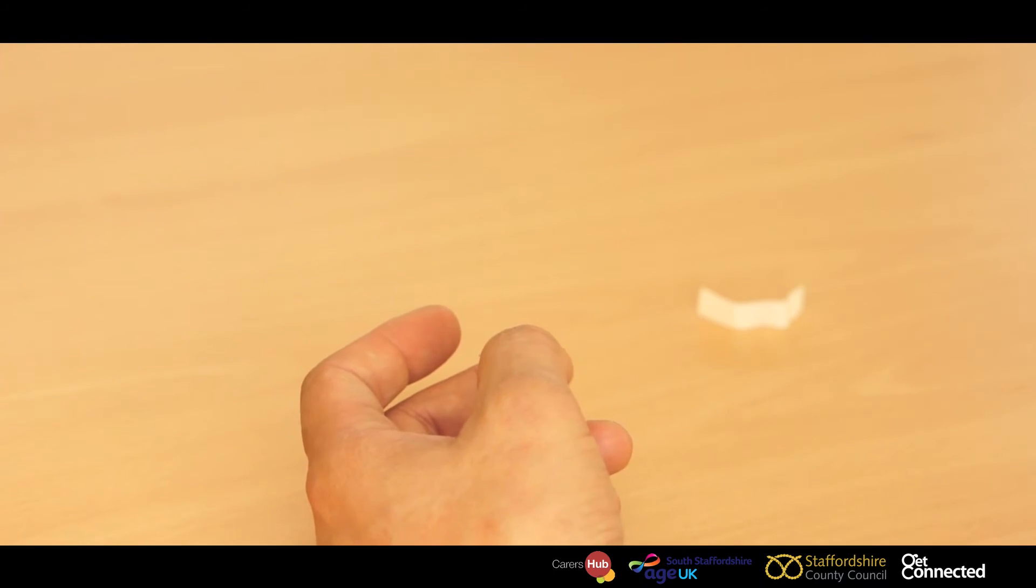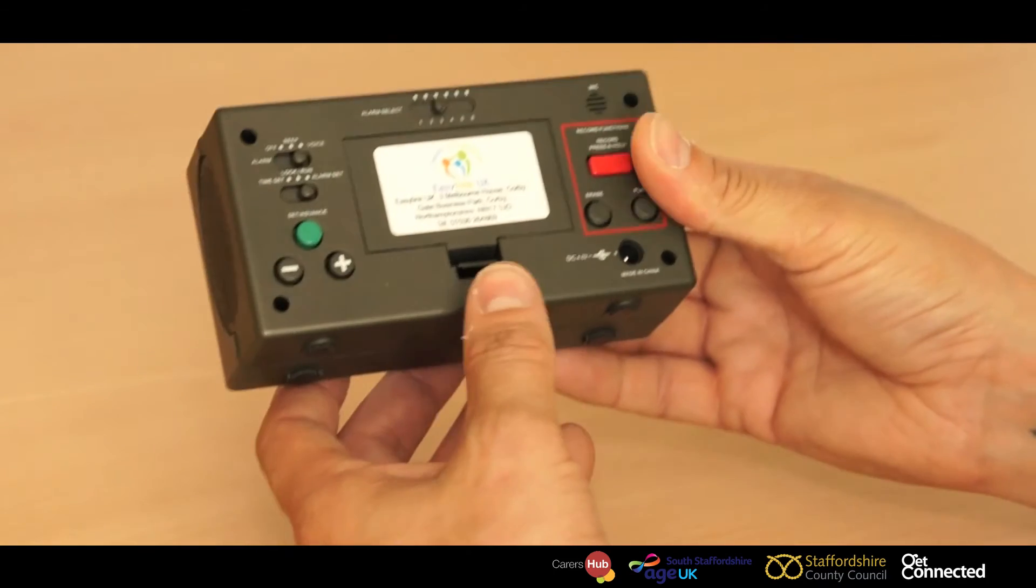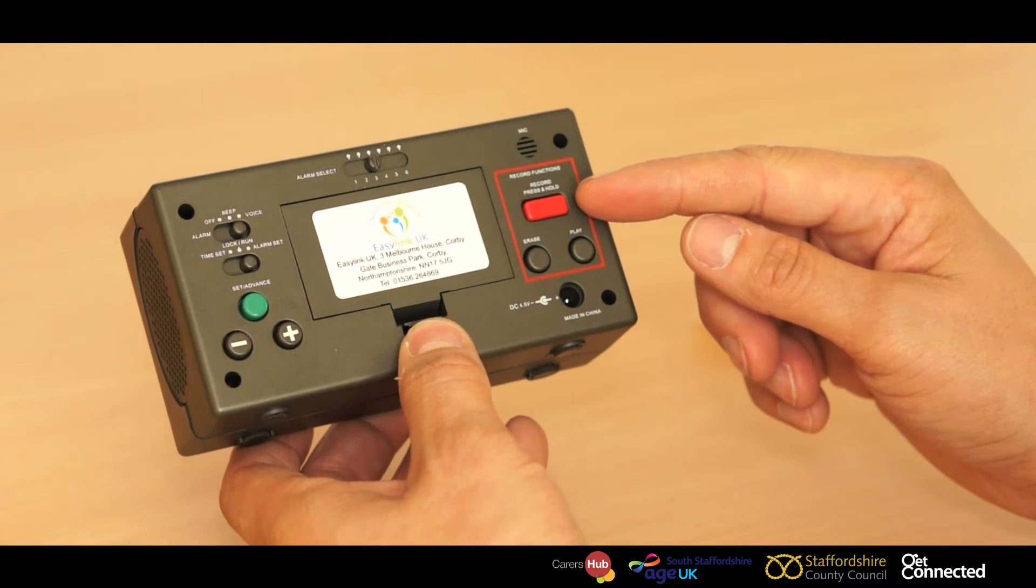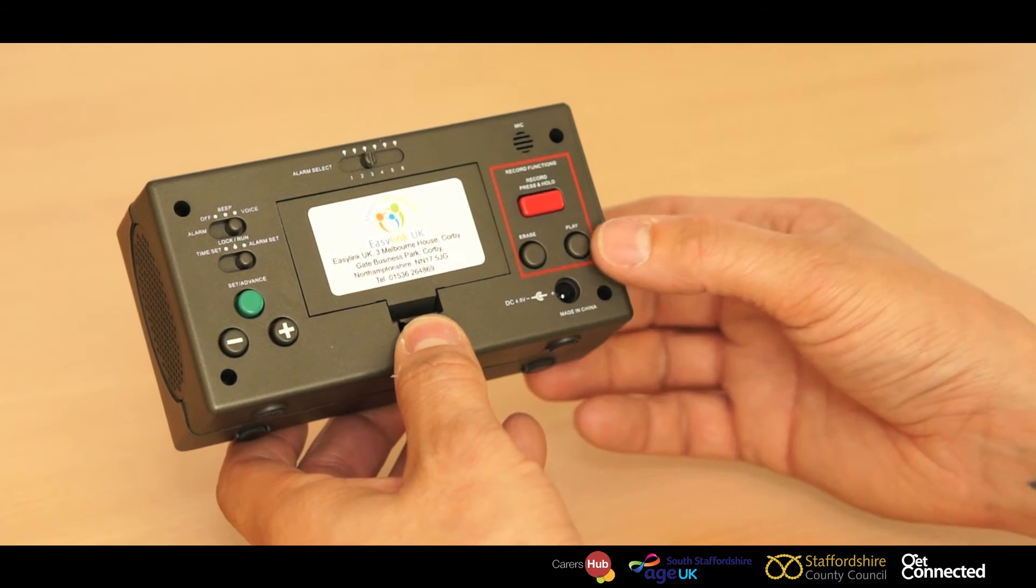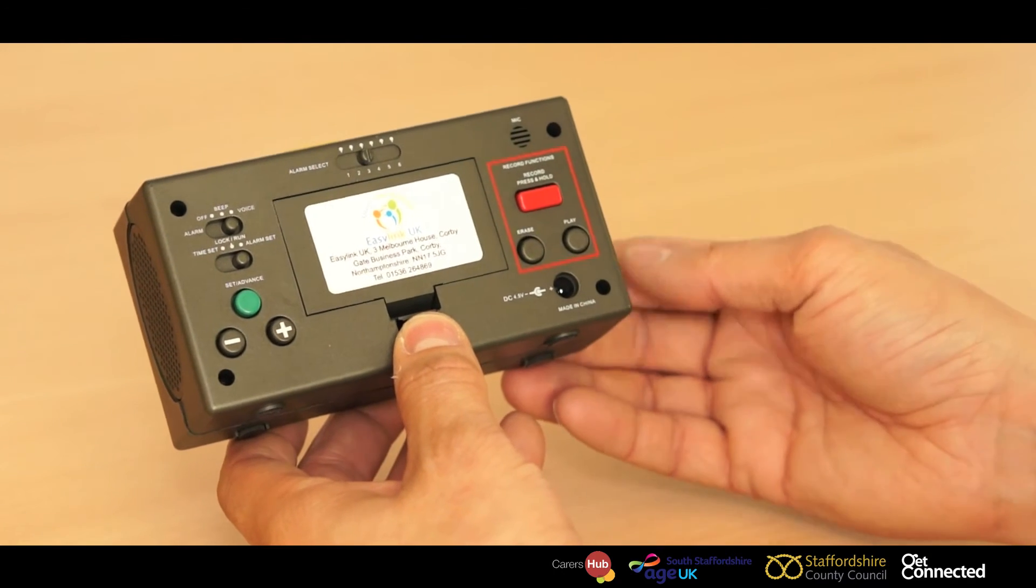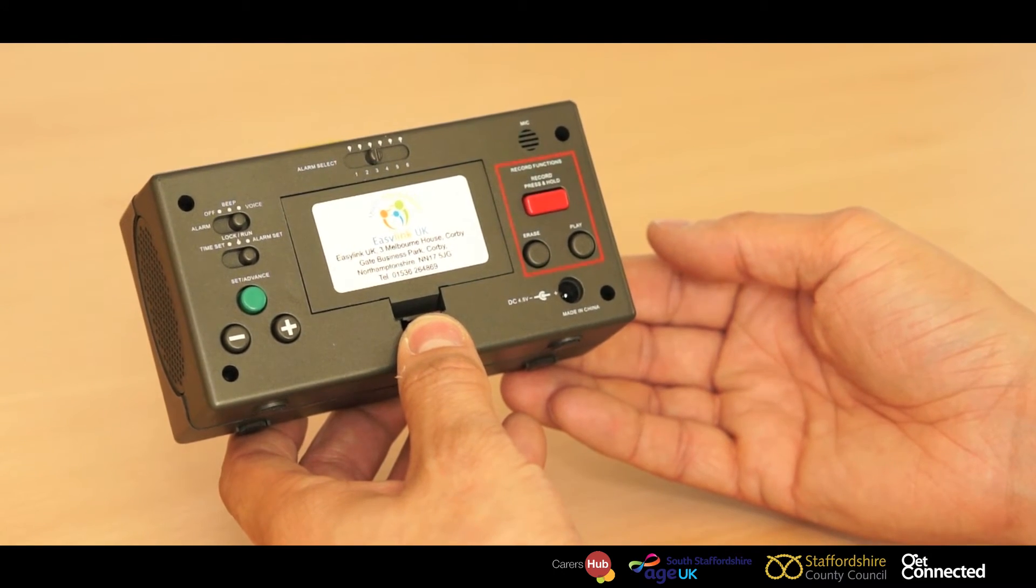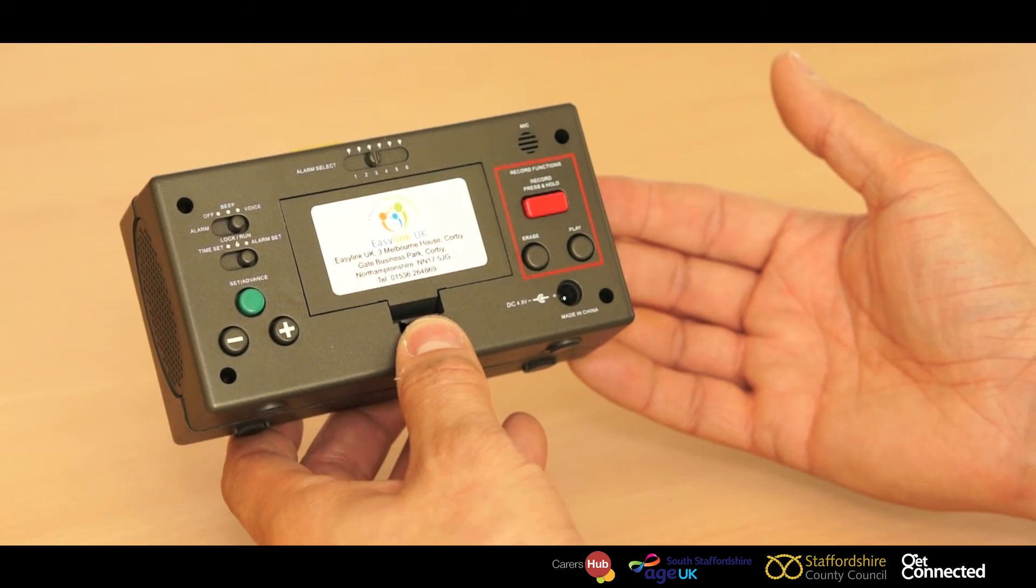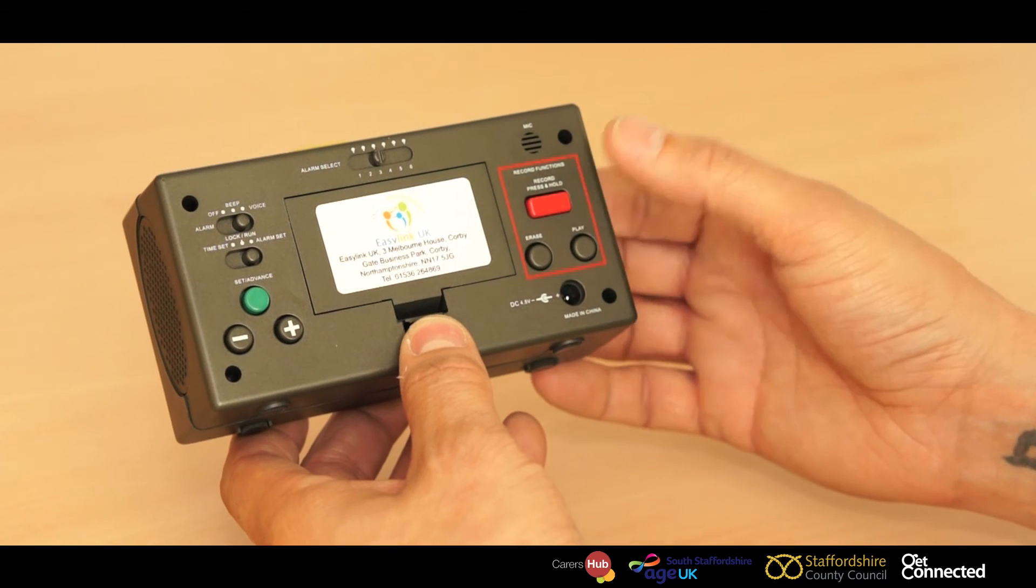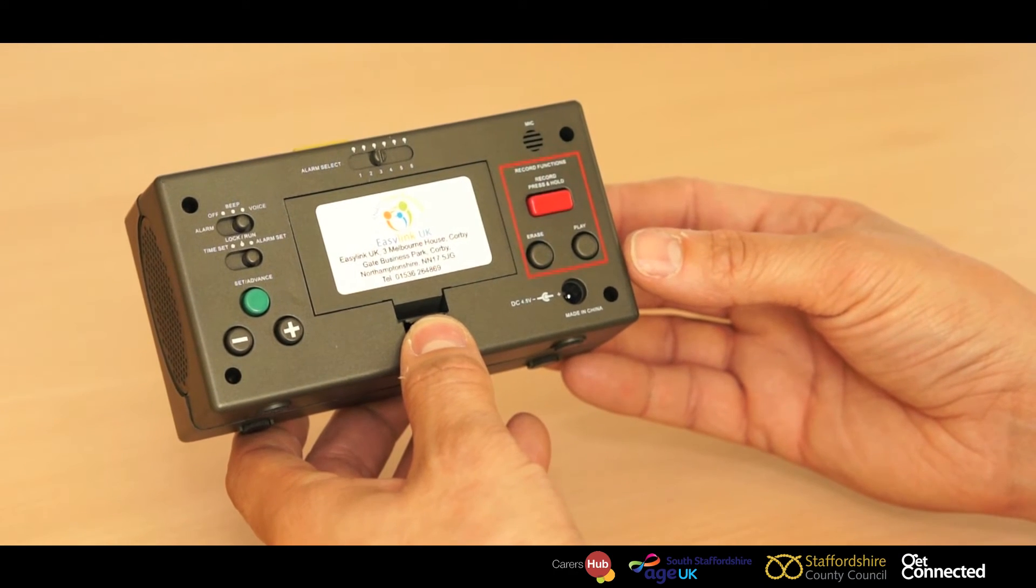So, hi mum, it's time to have some tablets. Push and hold that button for as long as you're talking. To replay the message, just press play. Hi mum, it's time to have some tablets. If you don't like the voice prompt for any reason, you just push and hold and record directly over the prompt.